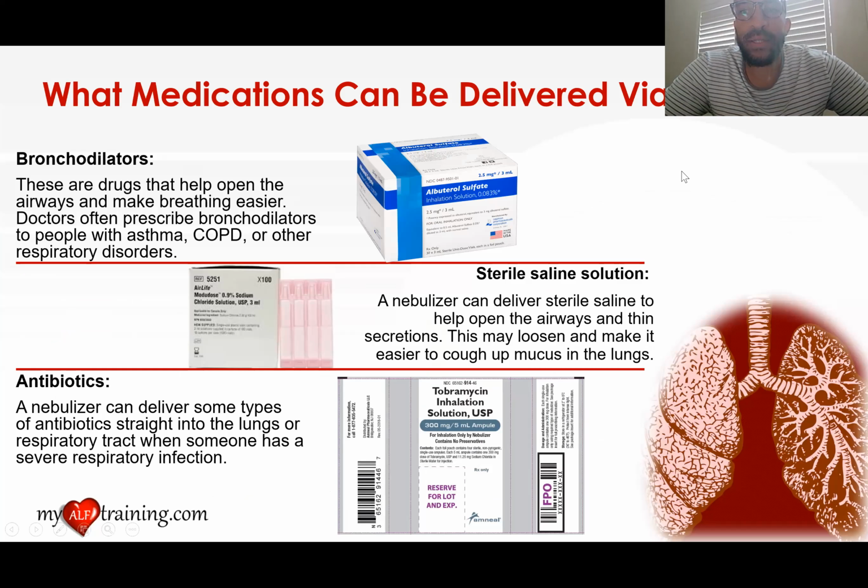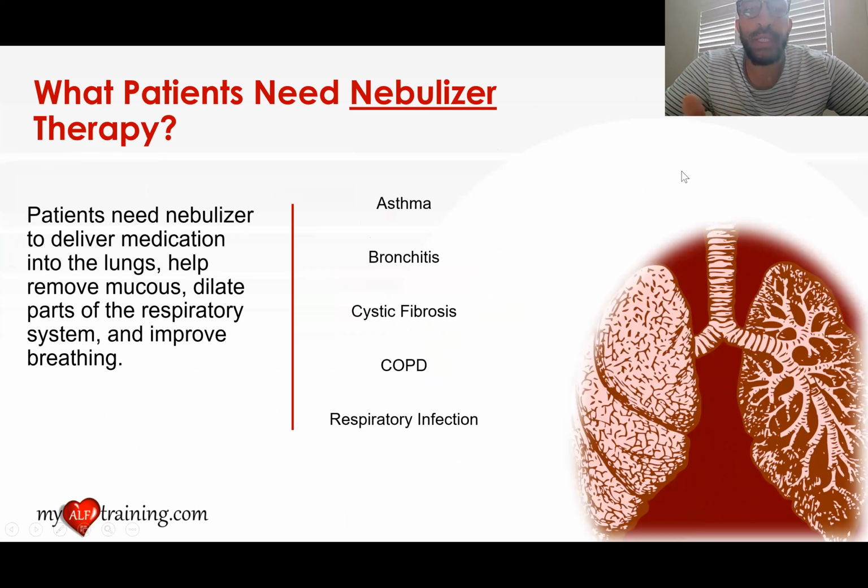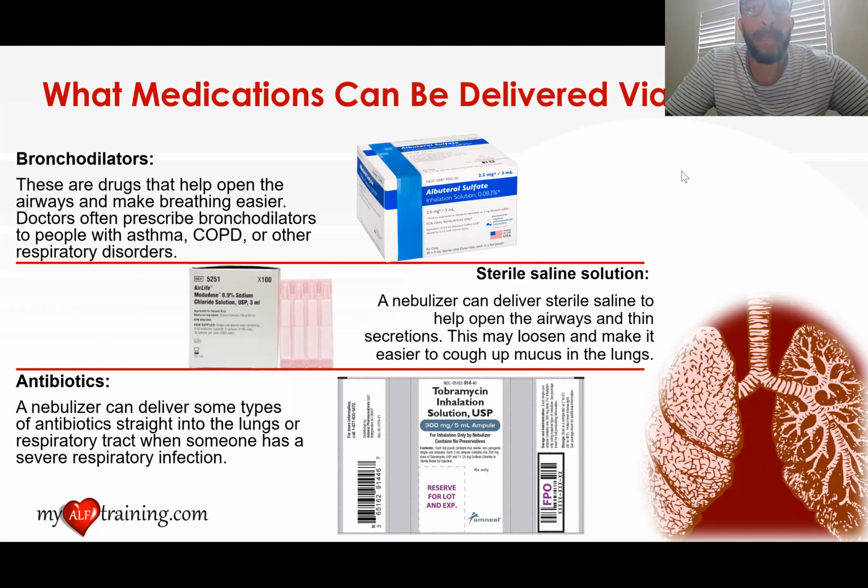So now back to where we left off. Right before this slide, you remember we were talking about the types of patients who actually need nebulizer therapy. So now we're going to talk about the medications that those patients might need. So what medications can be delivered?